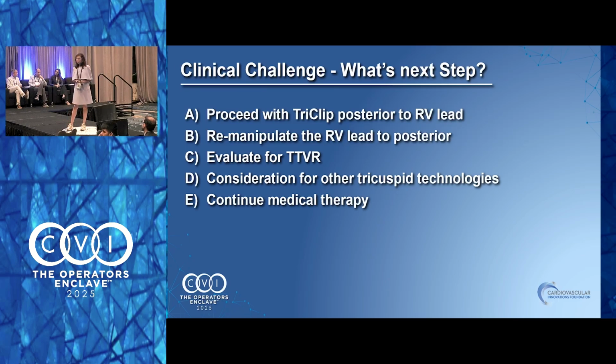Yeah. Okay. So there's a lot of talk about extracting because a lot of people have concerns about the ability to go back in if something happens. Scott, Firas, or either of you guys, are you extracting these before TTVR?